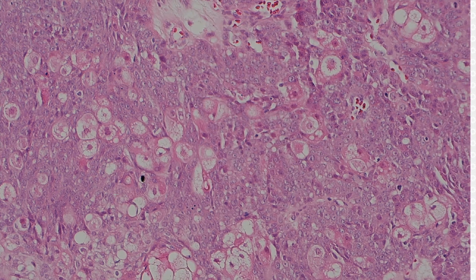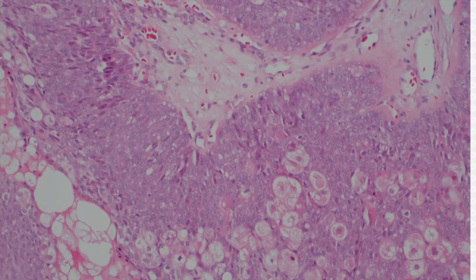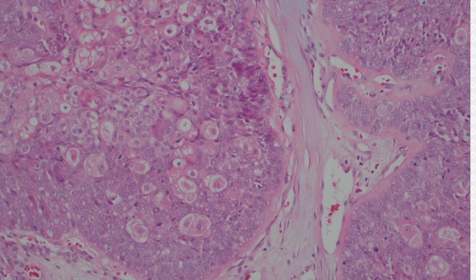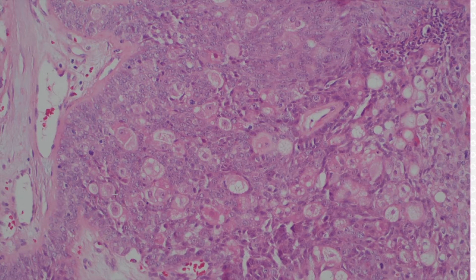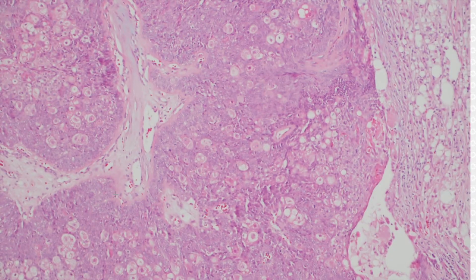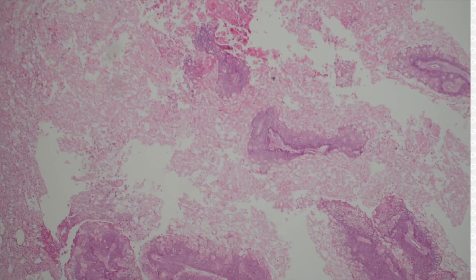There are clear-cut obvious mature sebacites in here, so the sebaceous differentiation is obvious — no stains needed. Those are definitely sebacites. The question is just deciding: is it benign or malignant? I would vote probably towards malignant here, but I could totally see someone saying they were comfortable with this being a big sebaceous adenoma or sebaceous adenoma with cystic change. It kind of just depends on your threshold and how comfortable you are.